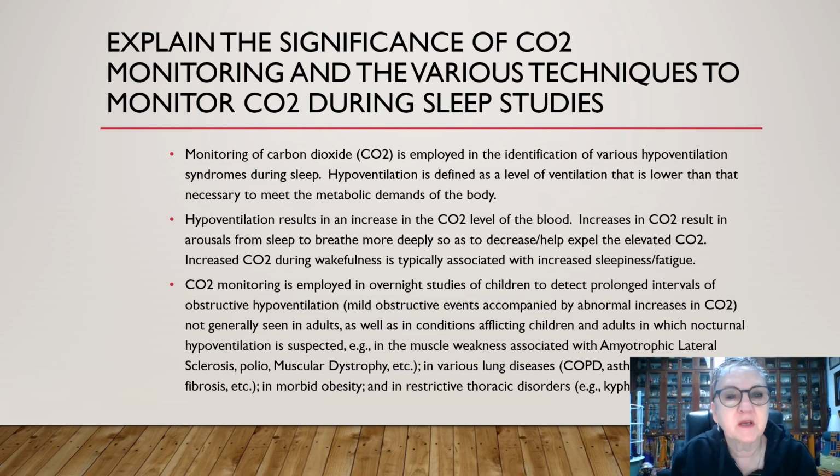Well, monitoring of carbon dioxide is employed in the identification of various hypoventilation syndromes during sleep. Hypoventilation is defined as the level of ventilation that is lower than that necessary to meet the metabolic demands of the body. Hypoventilation results in the increase of CO2 level in the blood. Increases in CO2 result in arousals from sleep to breathe more deeply so as to help expel the CO2. Increased CO2 during wakefulness is typically associated with increased sleepiness and fatigue.